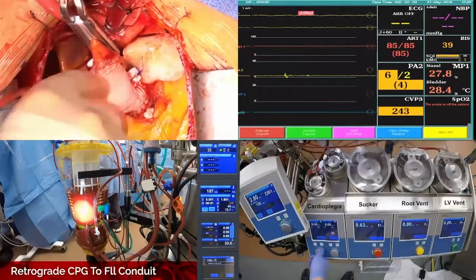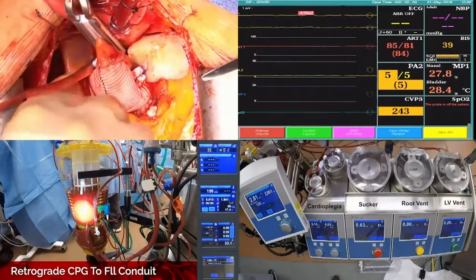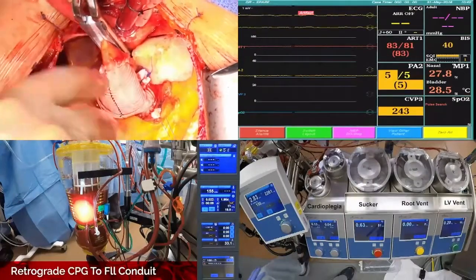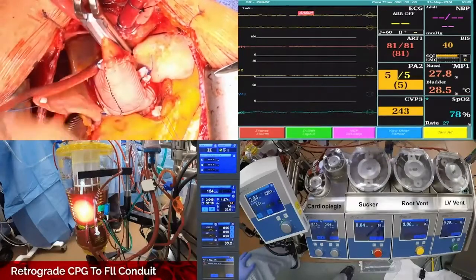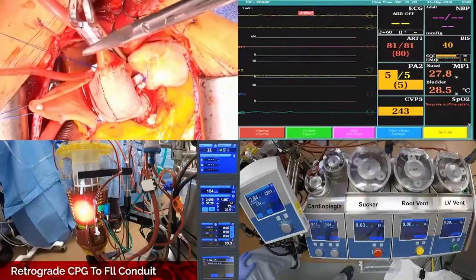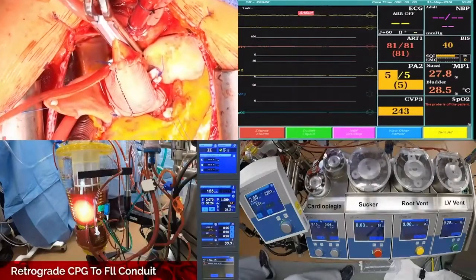Man, look at that. I know. I didn't even realize this was the shortest aortic root replacement, followed by valve reopening conduit that I've ever seen in my life. You know, you beat Cooley's time. I didn't use a running suture for my valve. I don't know how you ever did that. That's amazing.